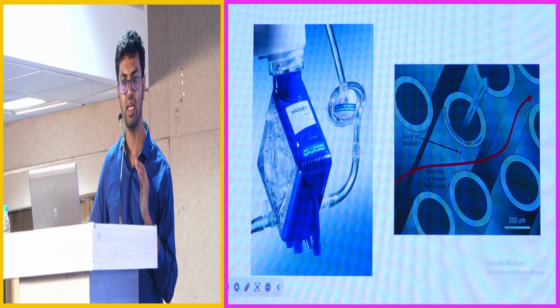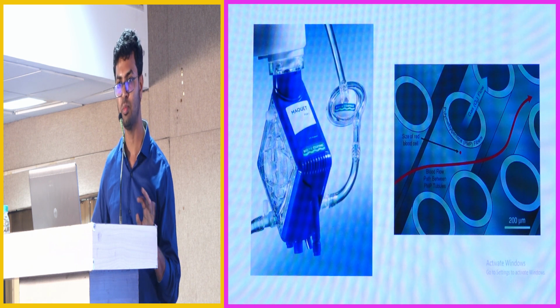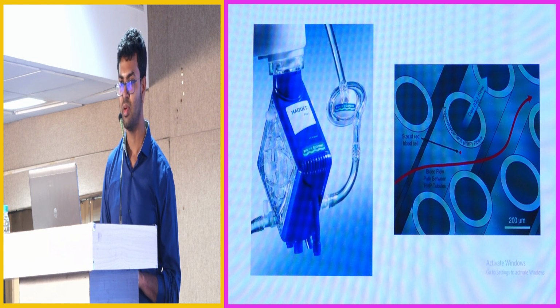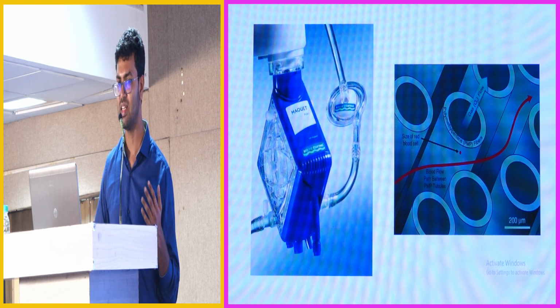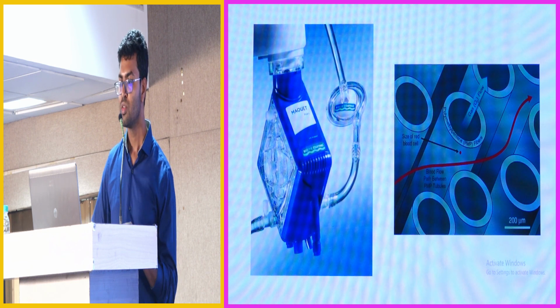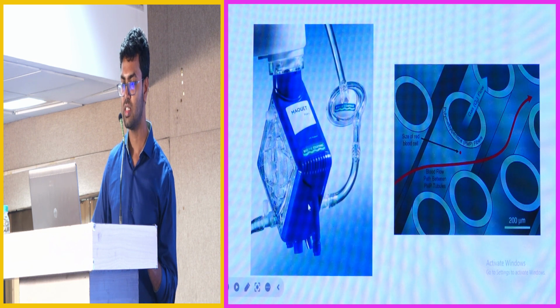This is a Maquet PLS system. There are various types of membrane oxygenator, but most commonly we use this Maquet. There is also the HLS system and also the Sorin system. Various different kinds of systems are there. What happens in this oxygenator is that the blood will come from here and exit from here, but within the membrane oxygenator there will be small polymethylpentene tubes. These are around 200 micrometers in diameter. You can compare the size of the RBC to the size of the tubes here.